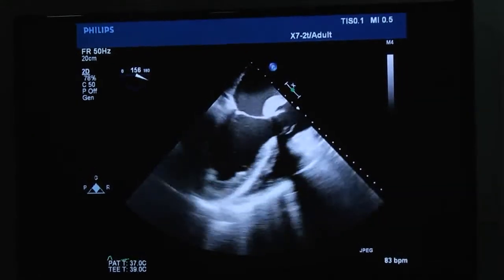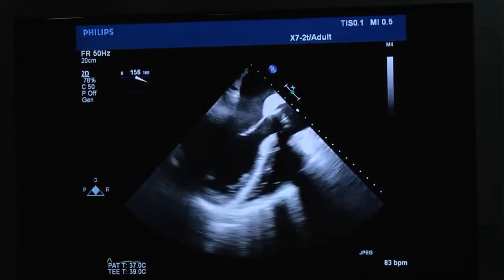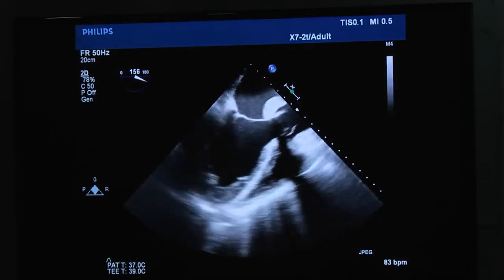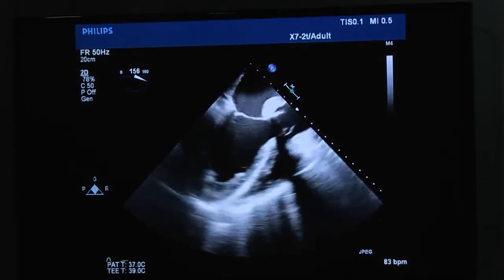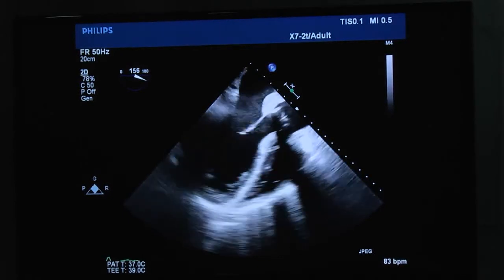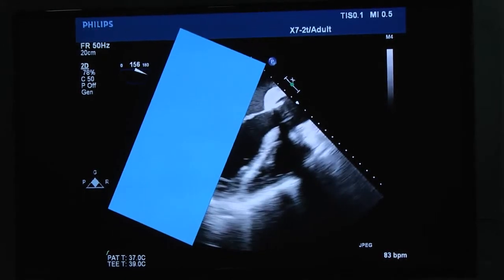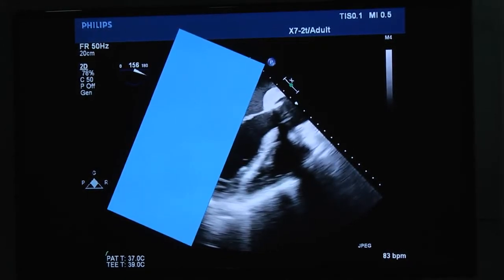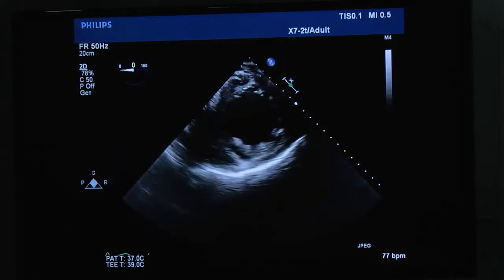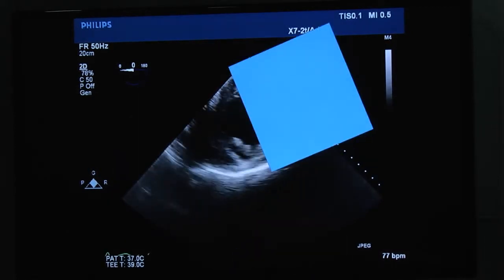To perform the regional analysis, I like to focus my attention on the wall we want to study. We can zoom in, or simply, just with a piece of paper, cover the rest of the heart and focus on our image. You may notice that the mid-anteroseptal wall is not getting thicker and is not moving very much, and we confirm that by the short axis view.